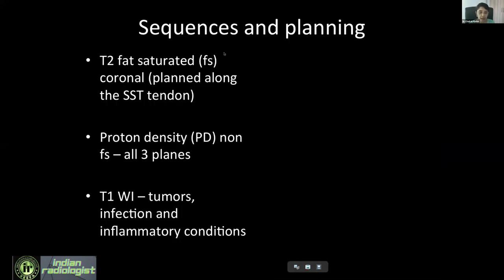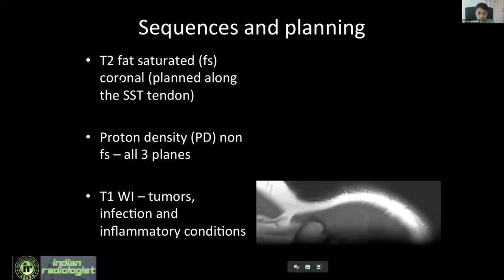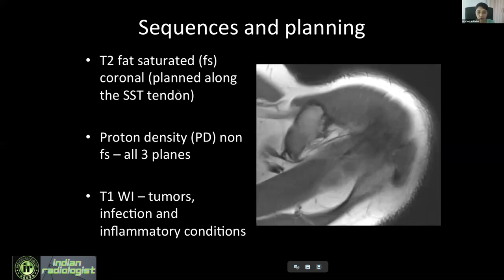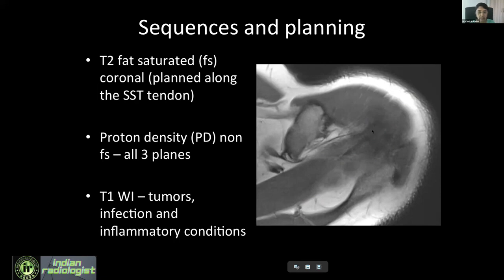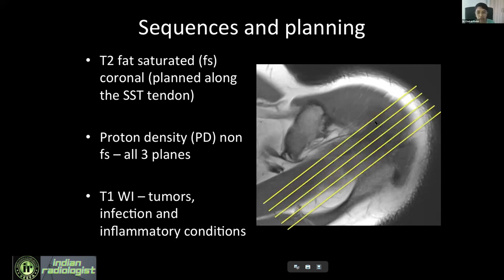Whenever you do an MRI shoulder, the sequences we take include a T2 fat-saturated coronal sequence. You can add or subtract sequences depending on your personal preference and experience. The important thing is the planning of the coronal sequence — whenever you take a coronal, plan it on an axial. The planning should not be along the muscle but along the tendon. You can see the jet-black supraspinatus tendon in the axial plane — plan your coronal along the supraspinatus tendon, and make sure you inform your technician of this.